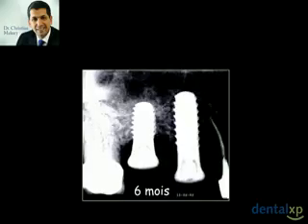So the idea is to place the implant, and by gently lifting the sinus membrane, this will allow for the formation of a blood clot between the implant and the sinus membrane, and the implant will play in this situation a tent-like effect on the membrane, and this blood clot will get transformed into vital bone within the months that follow the procedure.